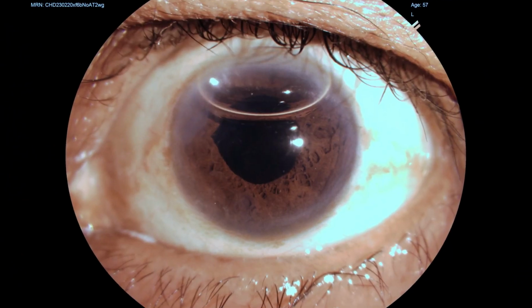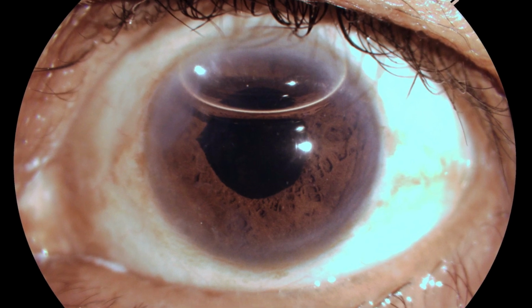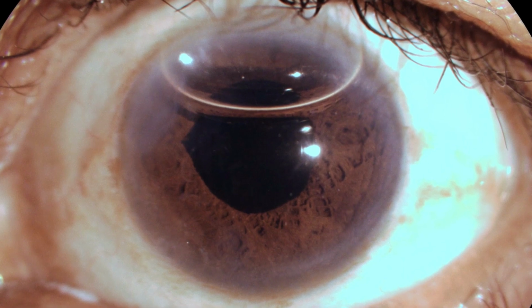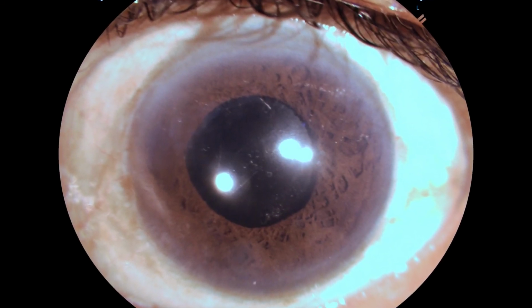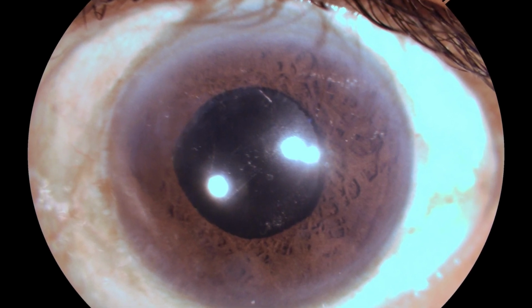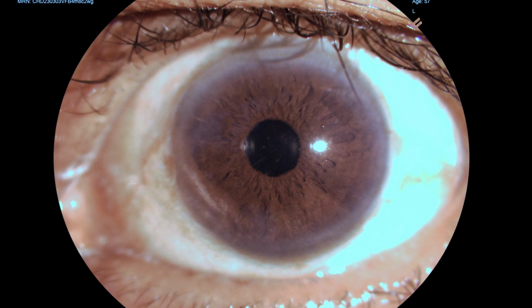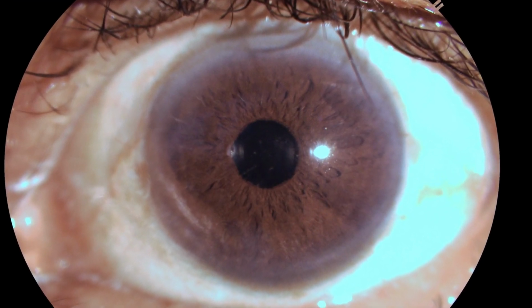This is the day 1 post-op picture. We can see the slight peaking of the pupil with the air bubble in place, IOL is well centered, and the chamber is well formed. This is the day 7 picture, which is apparently better, and the pupil is absolutely round. The mydriatic will be stopped since then, and then at day 30 we can see the pupil is absolutely fine, no peaking, and the patient has visual gain, which is good.